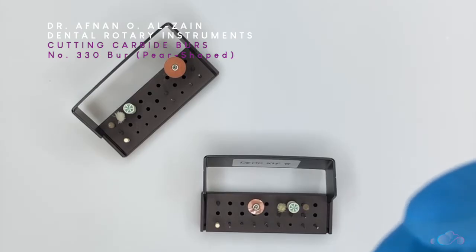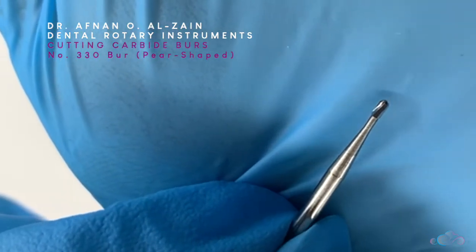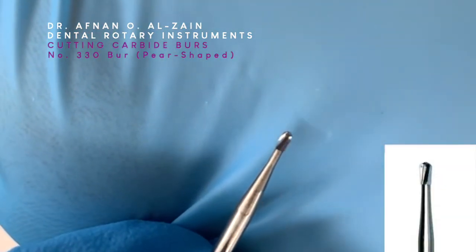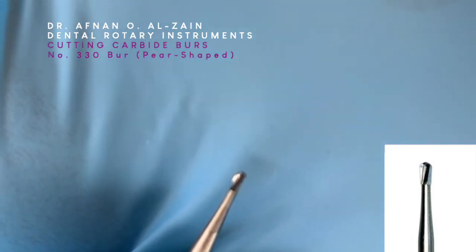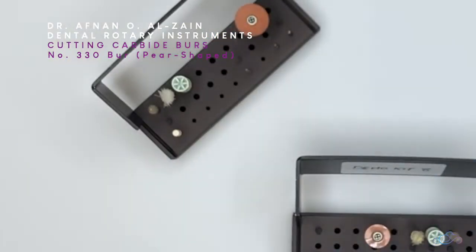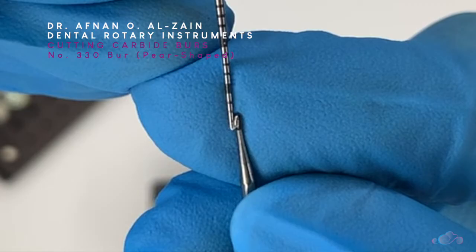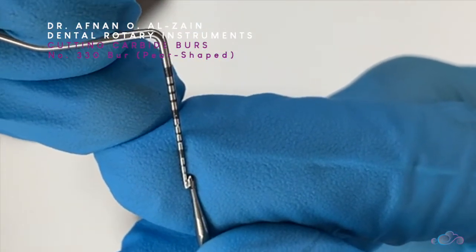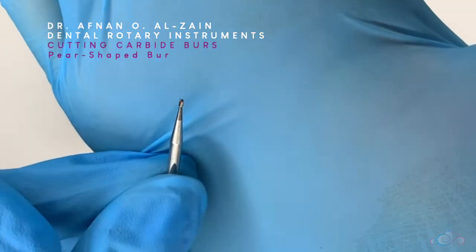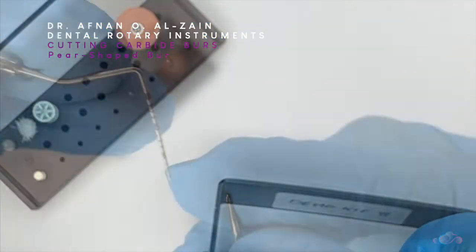Moving on to the following burr — this is the 330 burr, or pear-shaped burr. You can see that it is also not cylindrical, and it is pear-shaped and pointed on the top. When we measure its length using the perioprobe, we can see that its length is approximately one and a half millimeters. The following burr is also a pear-shaped burr, and we can see that it is more rounded on the top unlike the 330, but it is very similar to the 330.